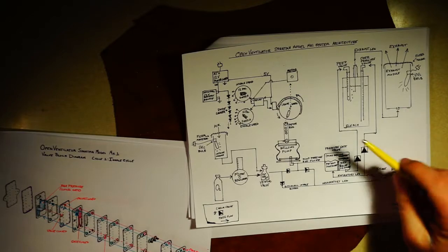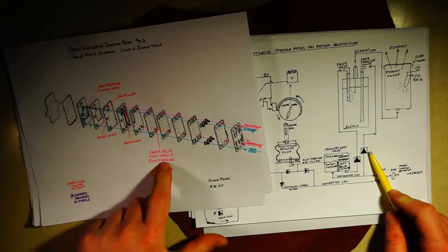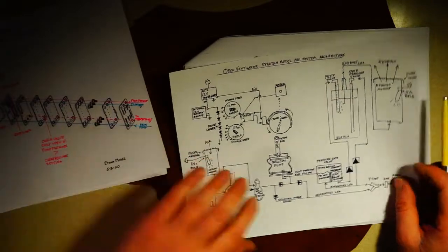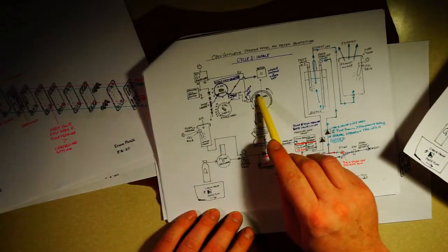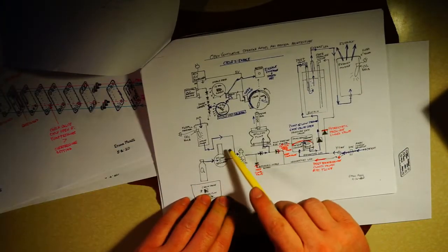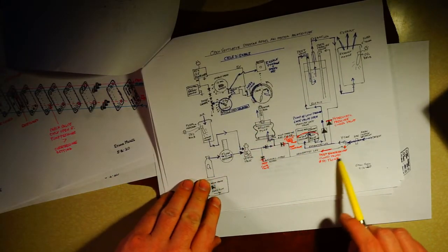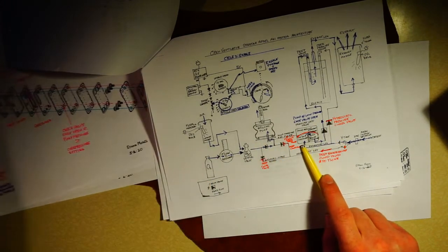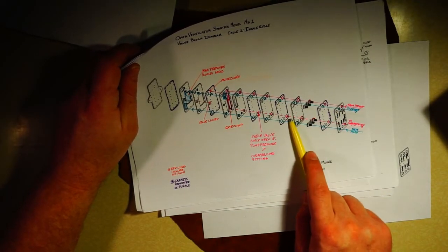One more thing that I wanted to mention is while I use this diagram to explain the cycle times, and we have cycle diagrams of the valve block, in the documentation there are also cycle diagrams in the system architecture. This is cycle 1, this is cycle 2, this is cycle 2A, and each one of these explains the flow of gas and pressure through this system that corresponds to the flow of gas and pressure through the physical diagram.